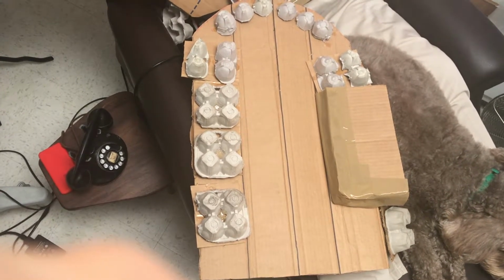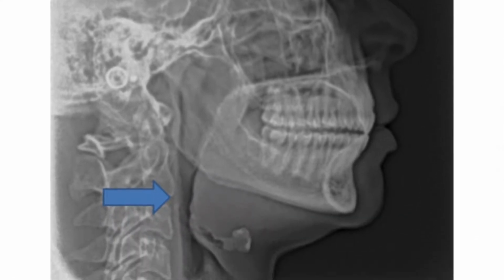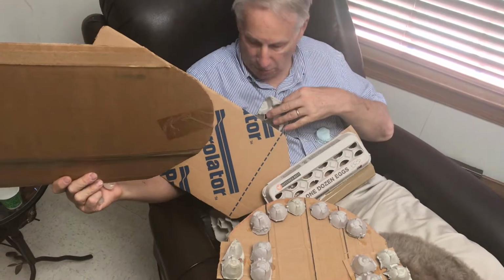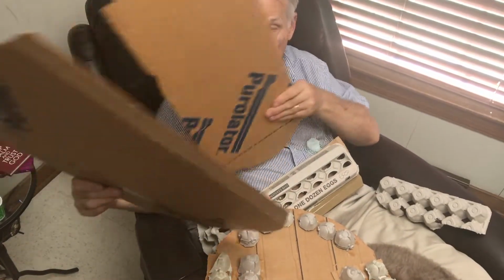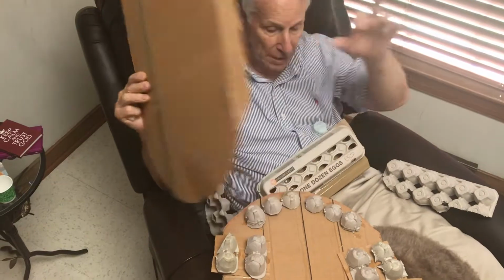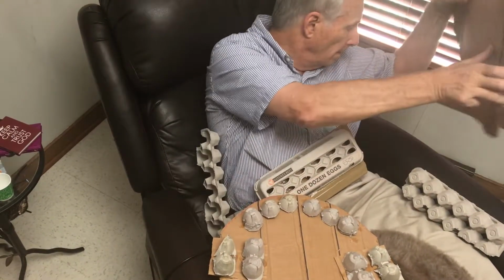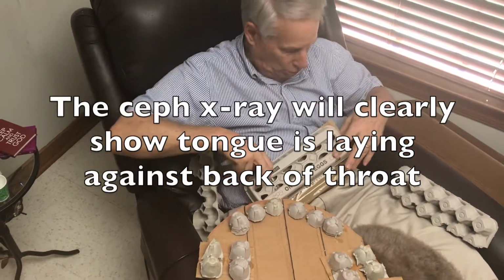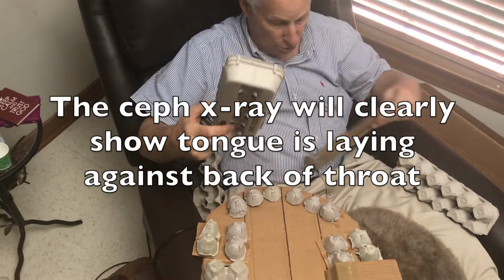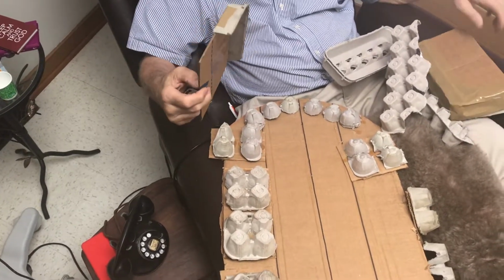You can verify this with a cephalometric x-ray, and you will find that many times the first thing you see is a tongue that is jammed right against the back of the throat. There are other times where it looks lost in space because you've got the same problem. It's just a little different view of it, but the cephalometric or lateral x-ray usually gives you enough information to make sense. And we want the tongue to come up through this groove that's there.